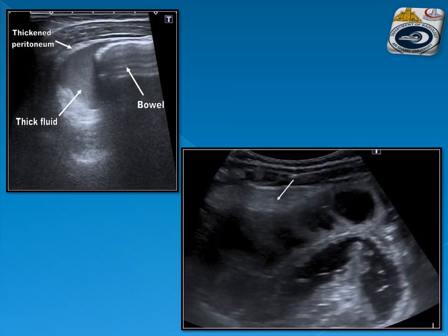Another example showing dilated bowel loops with turbid fluid, echogenic fat within the mesentery, dilated bowel loops, and a thickened peritoneum. We cannot assess the thickness of the peritoneum unless there is a sizable amount of fluid in order to see the thickened peritoneum.